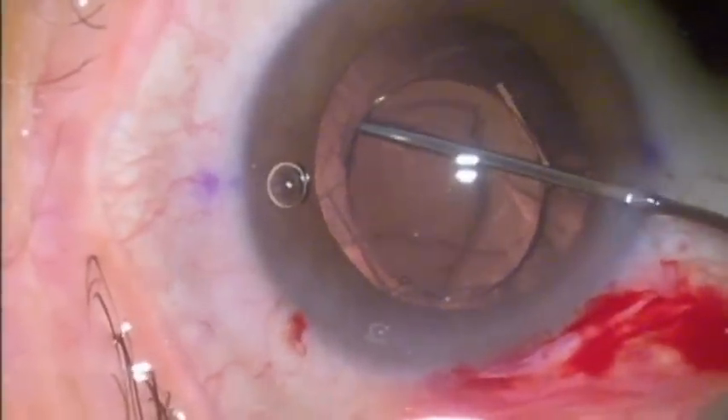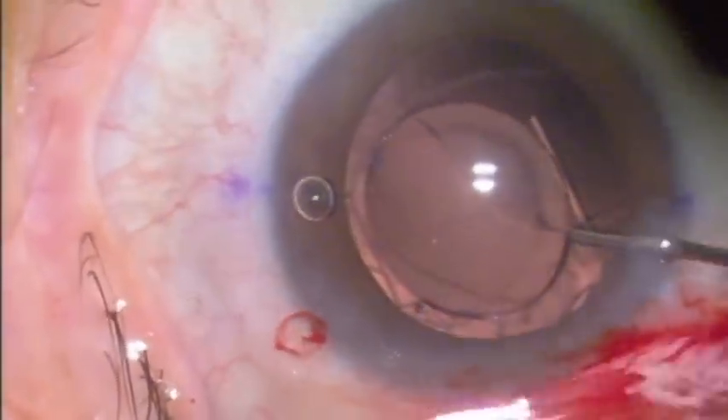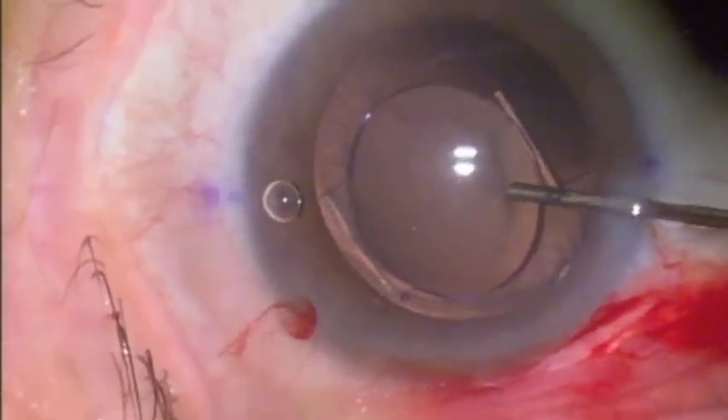A decision was made to exchange this lens, as my calculations show that with this implant, even if it were successfully repositioned, she would have had some hyperopia. We exchanged this 14 diopter lens for a 15 diopter lens.